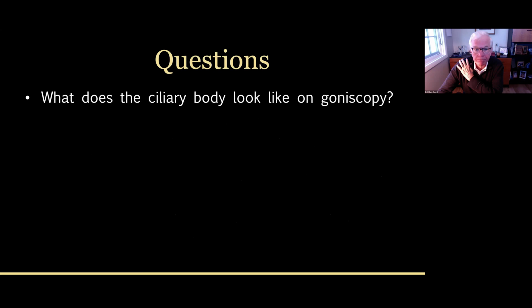What does a ciliary body look like on gonioscopy? When gonioscopy was first discovered by Trantas, he was actually trying to look at the ciliary body and accidentally discovered that he could see the angle. We don't usually see the ciliary body doing gonioscopy. I always tell my residents that if you see the ciliary body, something's wrong. You may not know what's wrong, but something's wrong.